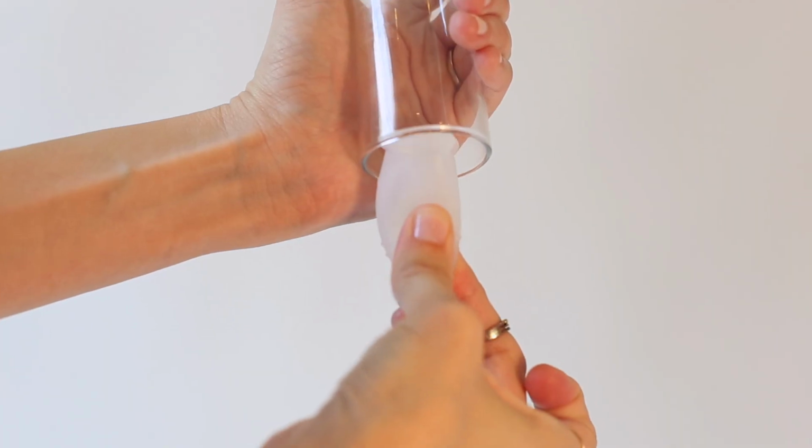It can be really frustrating when the cup opens too soon in your vagina, especially when you're brand new. So it's important to use a fold that you can ideally keep tightly folded using one hand, which is why the punch down is so great. But if you need to, use two hands. If the cup does open too early, you don't need to remove it right away. You can just see if you can nudge it on up. If that doesn't work, you'll probably want to try reinserting it.